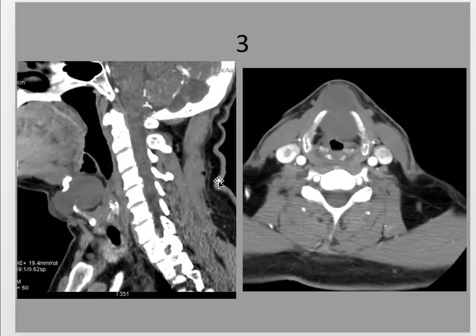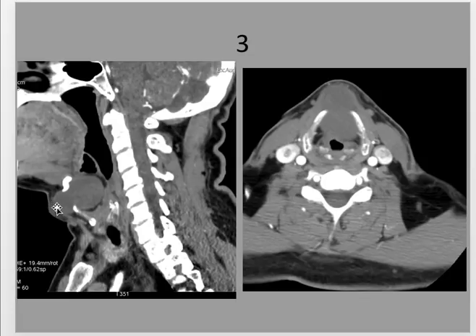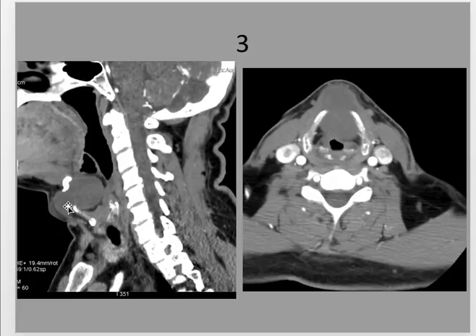This is a contrast CT — you can see contrast within the vertebral arteries and the carotid arteries. Always look at the vessels to determine whether it is a non-contrast or contrast CT. The abnormality here is a fluid density lesion present below the hyoid bone, giving a bilobed appearance, and it's located in the midline — the mid-sagittal plane — as seen clearly in the axial section. Based on the location, size, and shape of this lesion diving below the hyoid bone, this is a classic case of thyroglossal duct cyst.